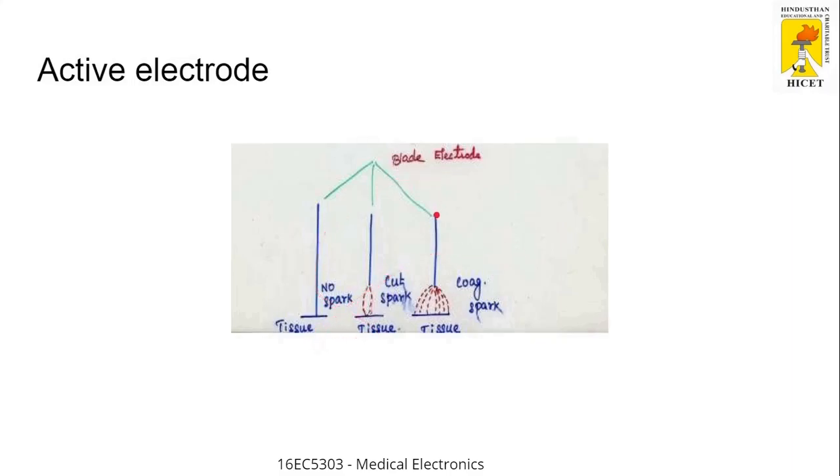As I told you, you have two electrodes: monopolar and bipolar. In monopolar, you have one main electrode and another, the reference electrode, which we saw in the previous session. There was a surgical unit diagram in which a doctor was doing a surgery. The bed over which the patient is lying has an electrode called the reference electrode. That type is called monopolar electrodes.